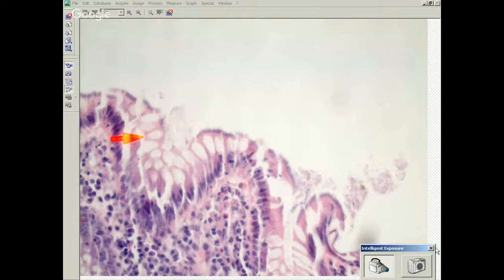They're spirochetes, so they're going to stain with both a spirochete immunostain or a Warthin-Starry stain as well. They're very common in patients with HIV, also men who have sex with men. Oftentimes they have no symptoms, but they can have some diarrhea or weight loss. This is an entity that we make the diagnosis of. It'll otherwise never be diagnosed. The only way to make the diagnosis is on colonic biopsy, and it takes someone to actually notice it.